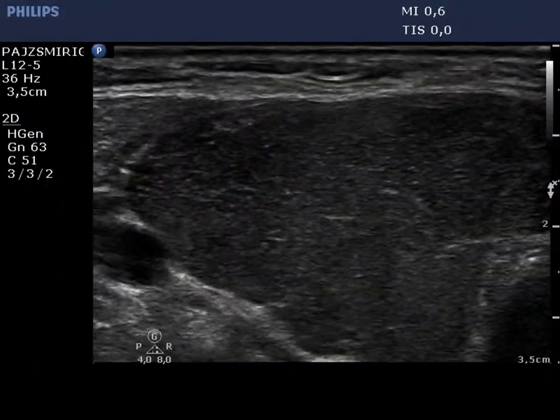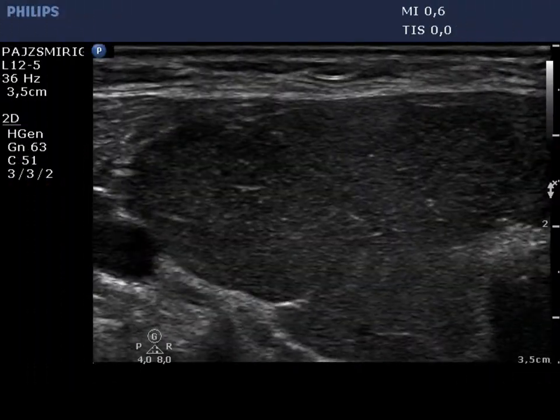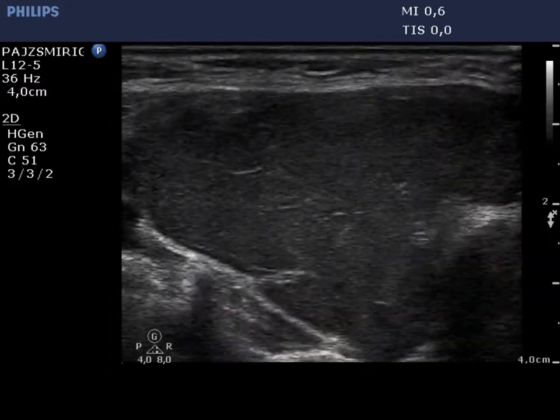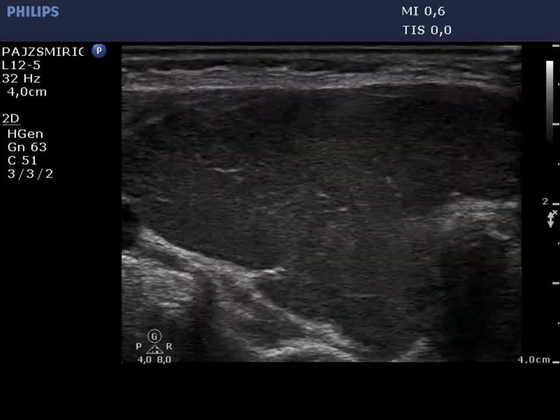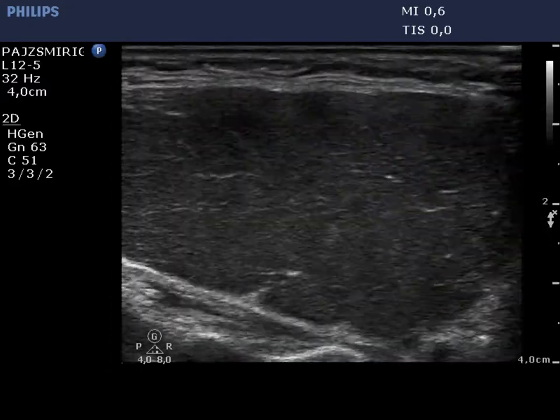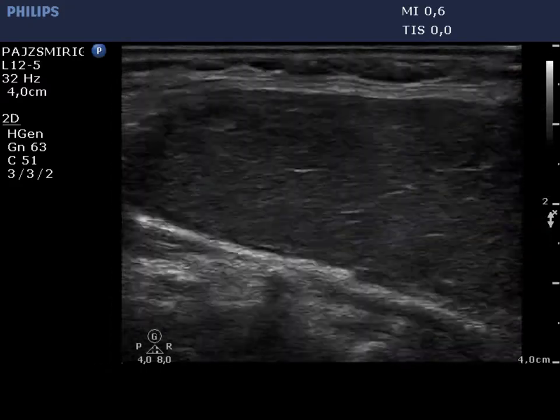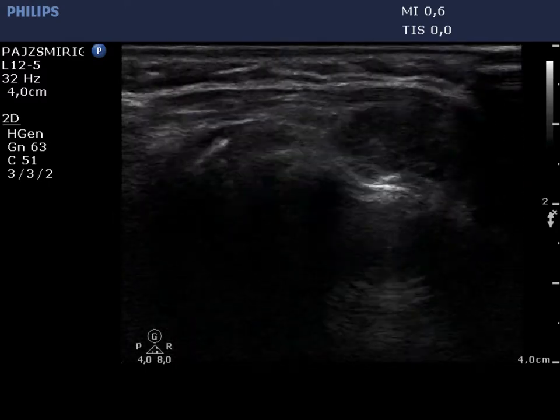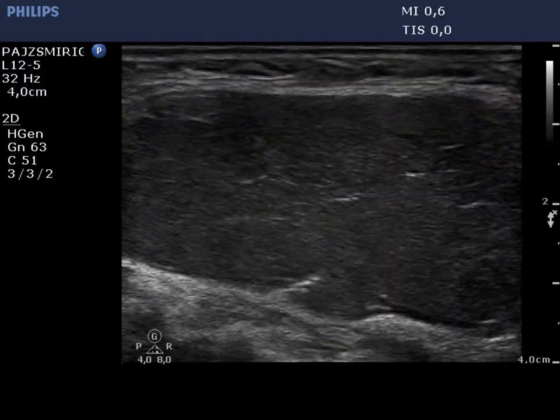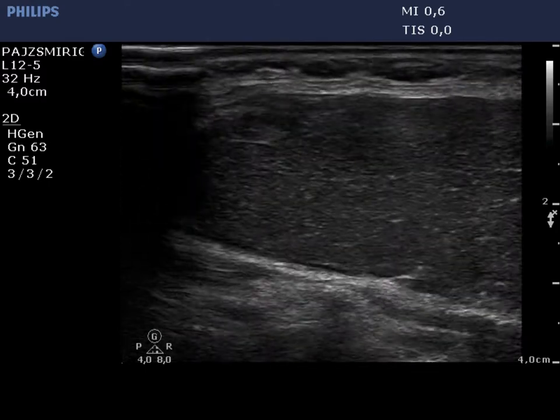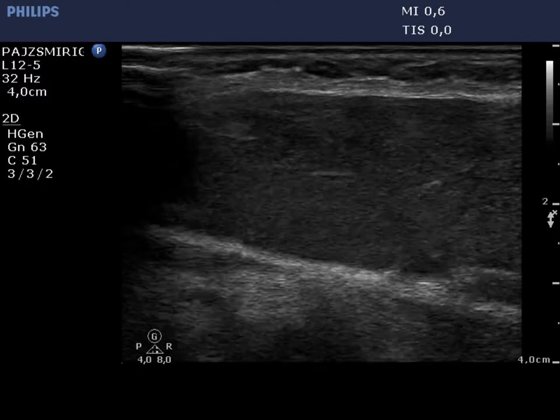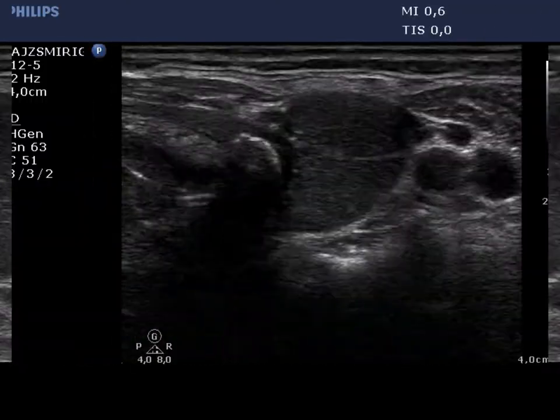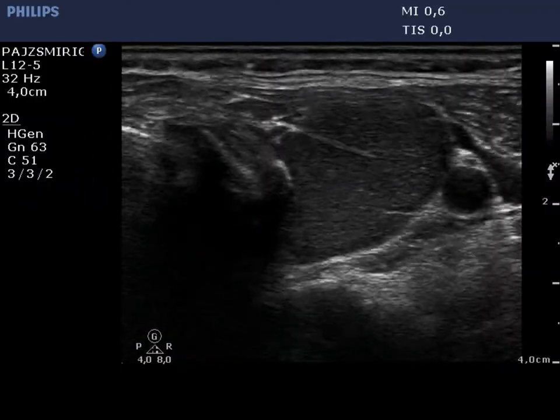In the video, at first the horizontal view of the right thyroid, then the longitudinal scan can be observed. It is worth noting the presence of fine connective tissue, which is rarely seen in intact or nodular goiters. This fine structure divides the thyroid into subunits.